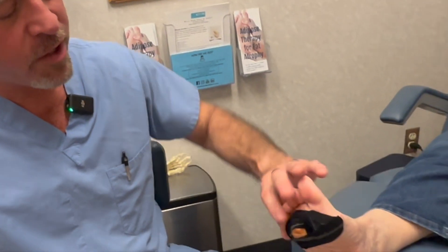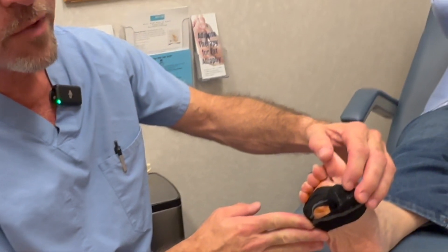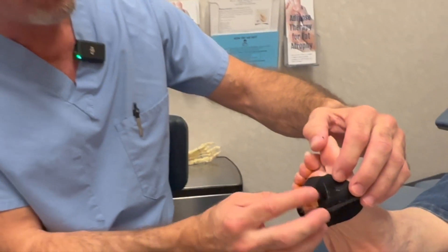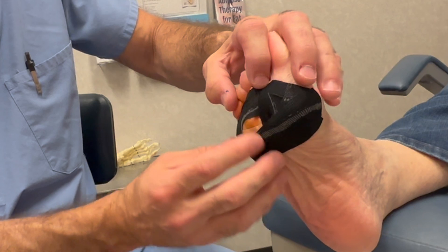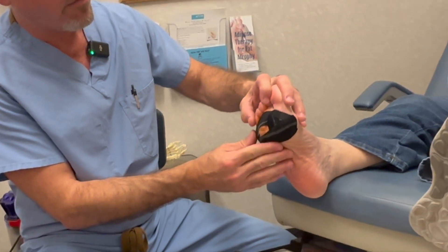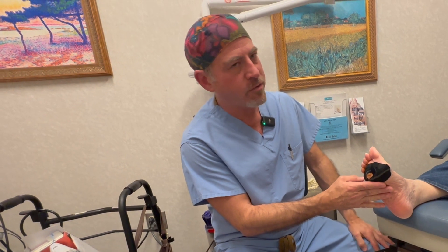We've given the injection, and what I'll typically do now is apply a waterproof KT tape. This will prevent the tissue, which is right here, from moving around — because ordinarily adipose tissue can move everywhere. We want to try to keep it in that area until it kind of settles in. But that's all we'll do, and she's able to walk on this immediately with very little discomfort.